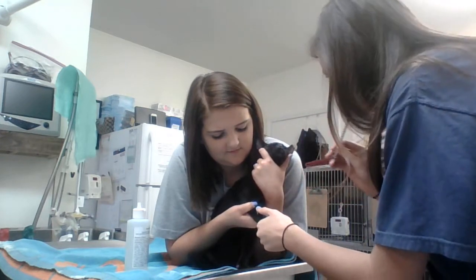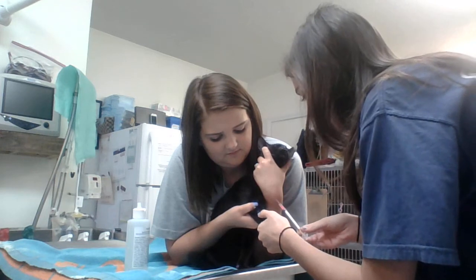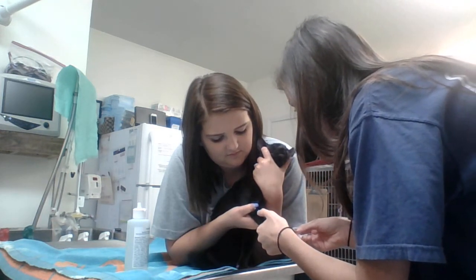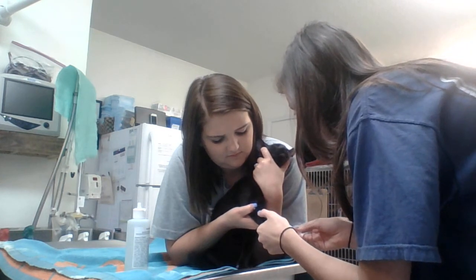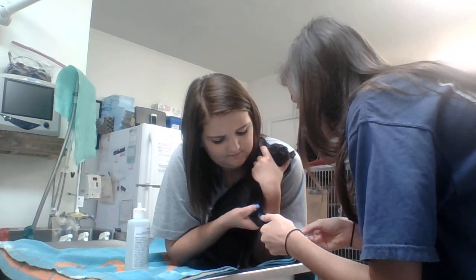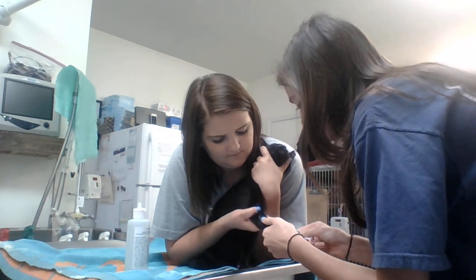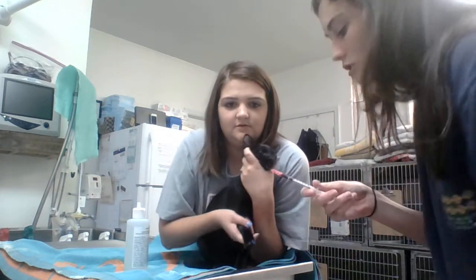So I take my cap off and I put my bevel up. Give me 30 seconds. And then I pull back on my syringe, and then I'll ask my holder to hold off to keep a hematoma from forming.